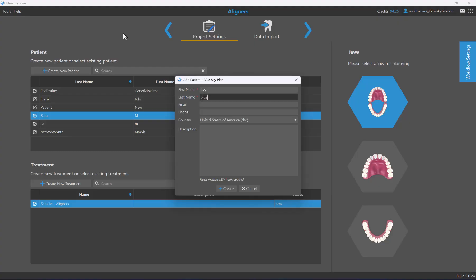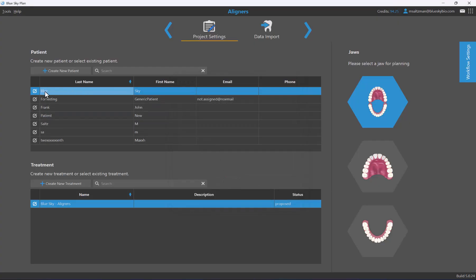You can enter the patient's name and a unique patient identifier. I'll create a patient called Sky Blue. The additional fields are optional but are most relevant if you're creating an aligner case and activating Blue Sky Monitoring for remote patient monitoring — in that situation the patient will receive notifications via email and messaging as to when to do scans and to communicate with you, the dentist.